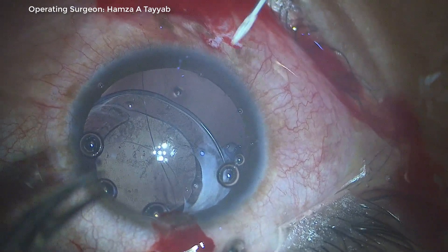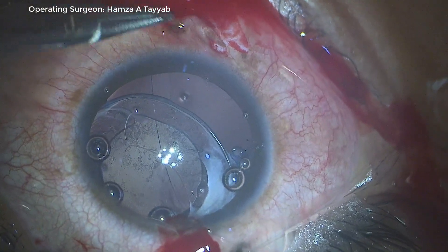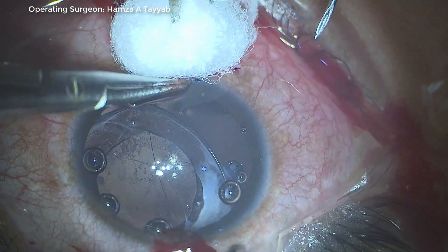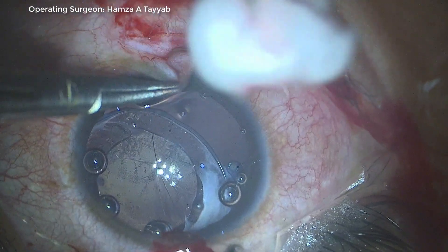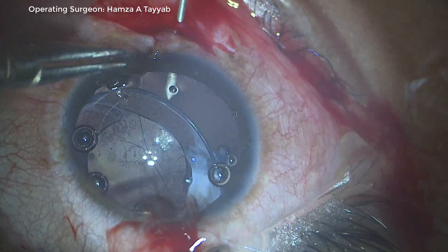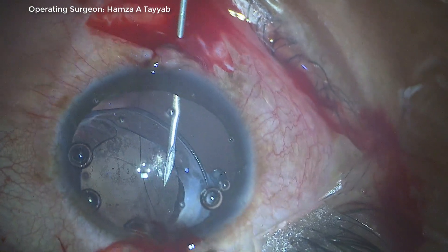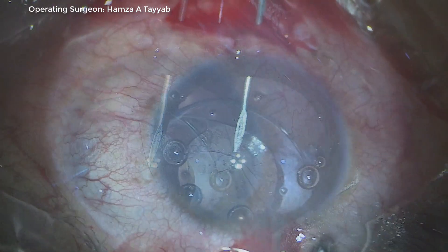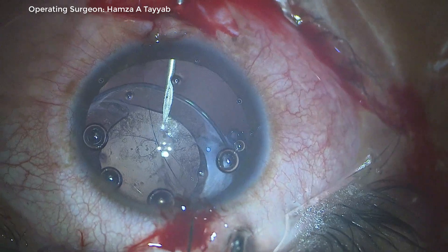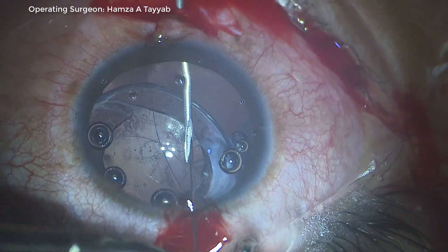Please observe that blood at the paracentesis is hindering my view, making it difficult to pass the 10-0 needle. This will have consequences — a 10-minute surgery will be extended to 30 minutes, as you will see later. I pass the 26-gauge needle above the CTR, and pass the 10-0 needle through the paracentesis, a little bit blindly. At this point I do not note the mistake I made.